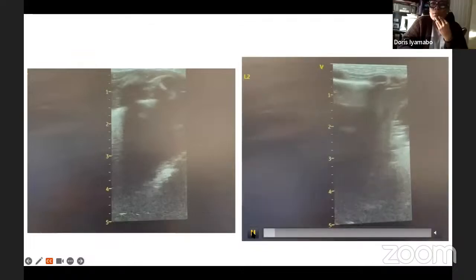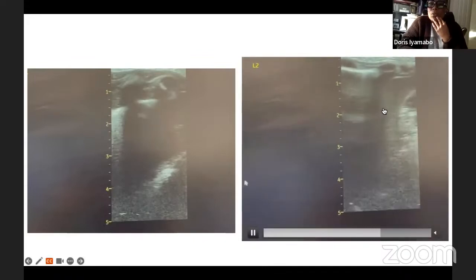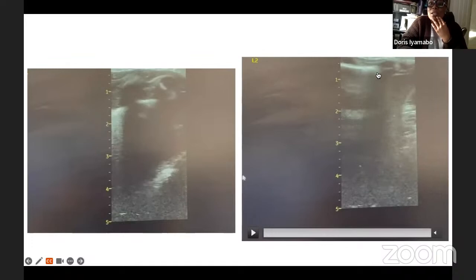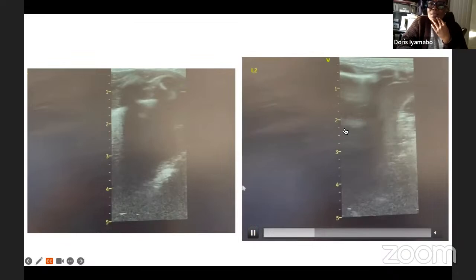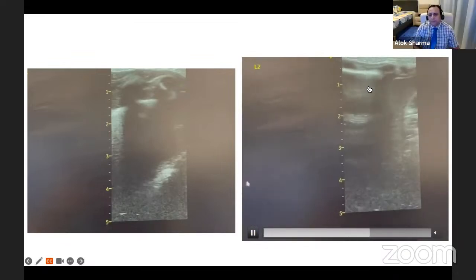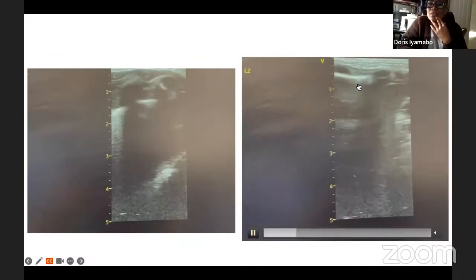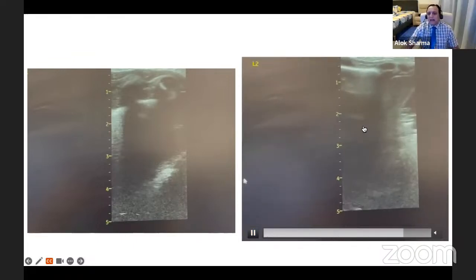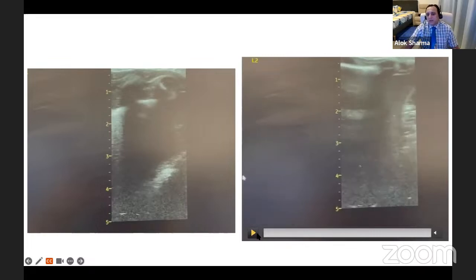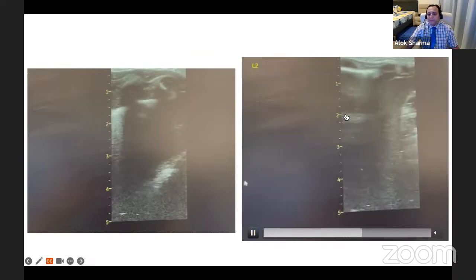Thank you. And then L2, below the nipple, anteriorly, this is what I got. I can still appreciate pleural sliding. These are A lines. B lines don't reach the bottom, so maybe I would say these are comet tails. Very good, absolutely, these are comet tails. Just in the middle of the screen at the 2-centimeter mark, can you see it? Come down, yep, there.